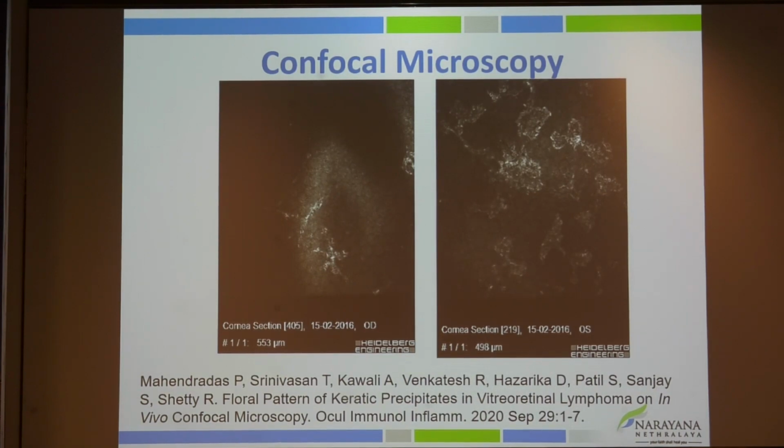Next is confocal microscopy in lymphoma, where we have various imaging biomarkers. In addition to OCT, confocal microscopy can be used to diagnose. Here we have complete or incomplete floral pattern which are present in intraocular lymphoma, which we recently published in Ocular Immunology and Inflammation.